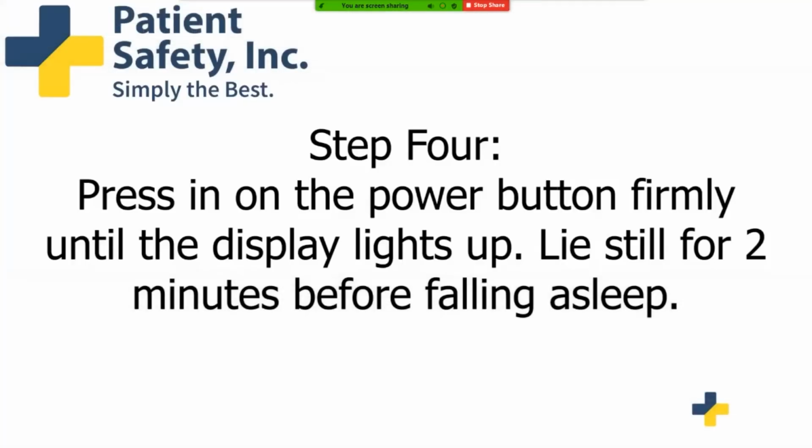Step 4. Press and hold the power button firmly until the display lights up. Lie still for 2 minutes before falling asleep.